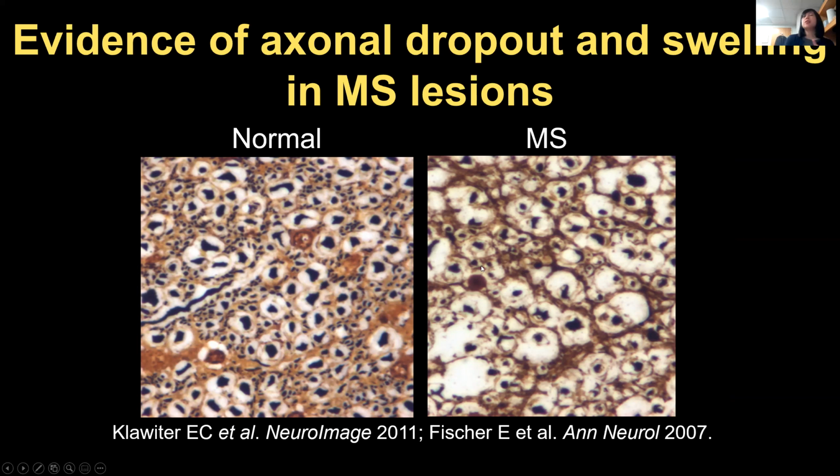And so it's not entirely clear what the process driving this observation of enlarged axons is. Could it be that smaller diameter axons are preferentially affected and it's the larger axons that are remaining? Could there be some sort of compensatory hypertrophy, and a selection toward the larger diameter axons to preserve conduction? So this is something that we're actively exploring through systematic histologic, pathologic, and then in vivo studies now on our Connectome scanner.